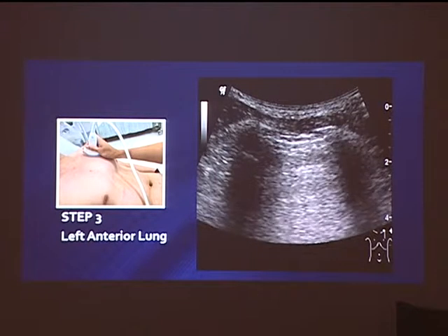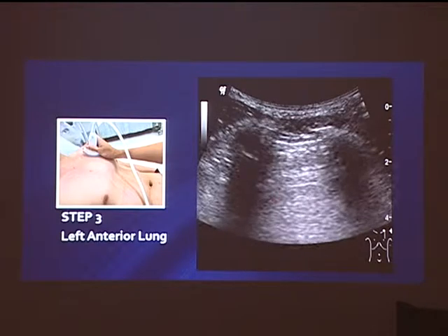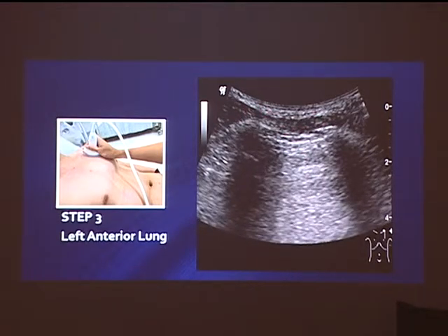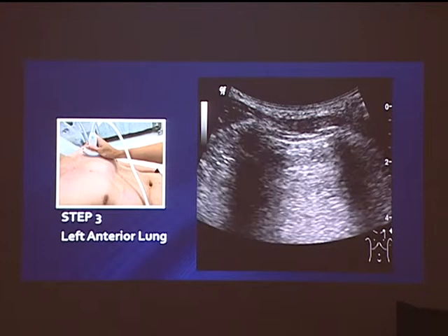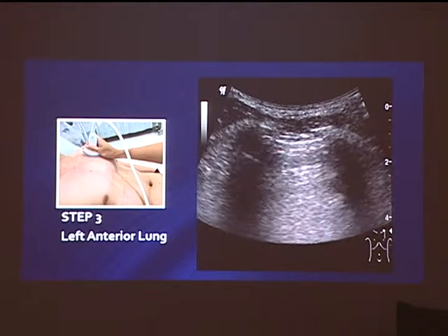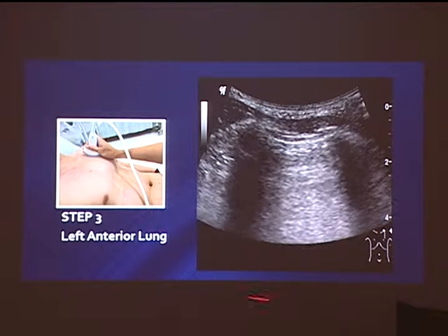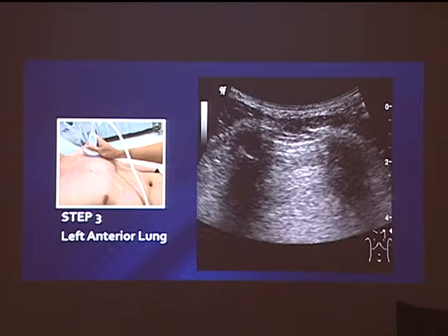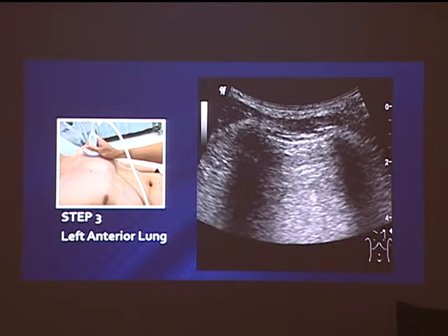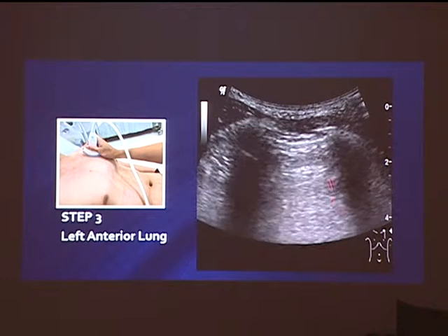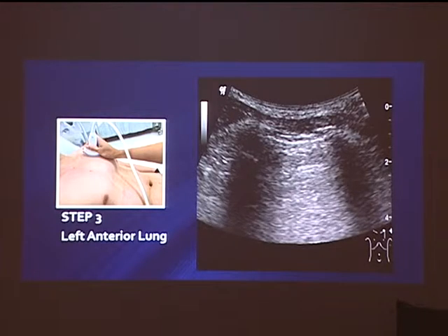What do you see here? There is no lung sliding. What you're seeing is just the chest wall trying to move when the patient breathes, but there's hardly any activity. This is a trauma patient with a chest injury and no lung sliding — it's pneumothorax.